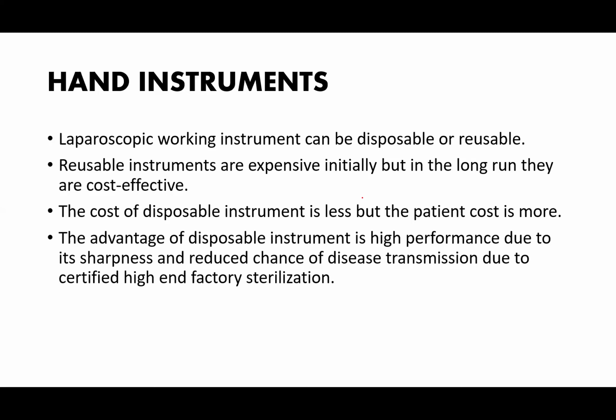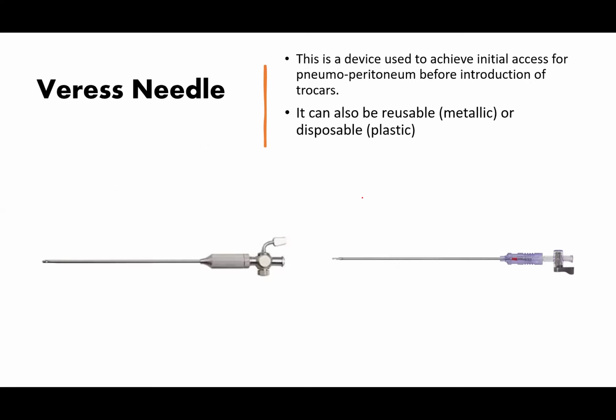The advantage of disposable instruments is high performance due to their sharpness, and reduced chance of disease transmission due to certified high-end factory sterilization.